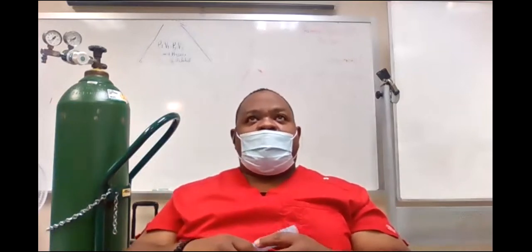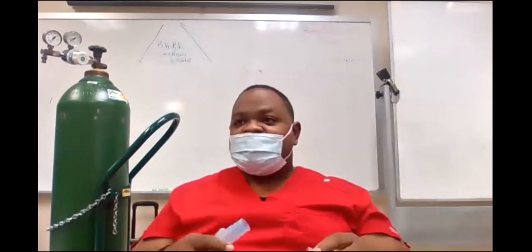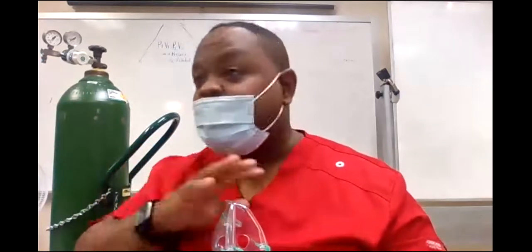And so if I have them on a 40% aerosol face mask, okay? I'm gonna find the face mask, set up my aerosol setup. He's on an aerosol face mask, and I'm gonna turn the Venturi to what? 40%. Screw it on to the flow meter and cut it up to the flow I'm supposed to have. And he's getting 40% no matter what.